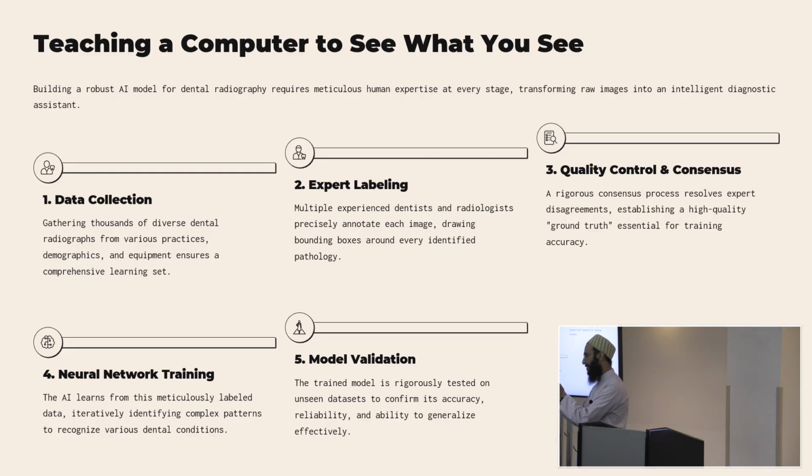And so each image that comes in gets separated into three sets. I'm going into a little bit of detail here, but it's just to make the broader point. One set, about 80% of them usually, are training images. The next 10% are effectively test images. Those are for the engineers who are training these models day to day, to help them understand how the model they're training daily is doing. And then the last 10% is used for evaluation.